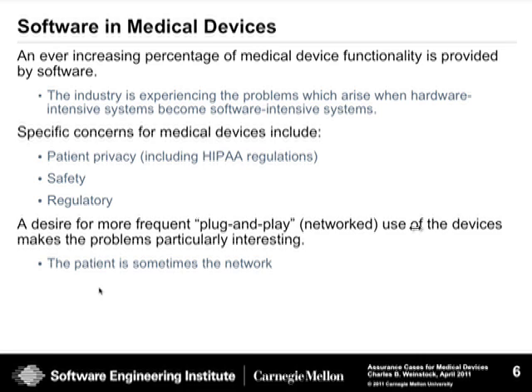The industry itself is moving towards plug and play, where the patient is actually part of the network. You have a heart monitor hooked to a patient, which is also hooked to an infusion pump, and there can be feedback where the patient is part of the network. So it's an interesting problem that we got involved in a number of years ago.